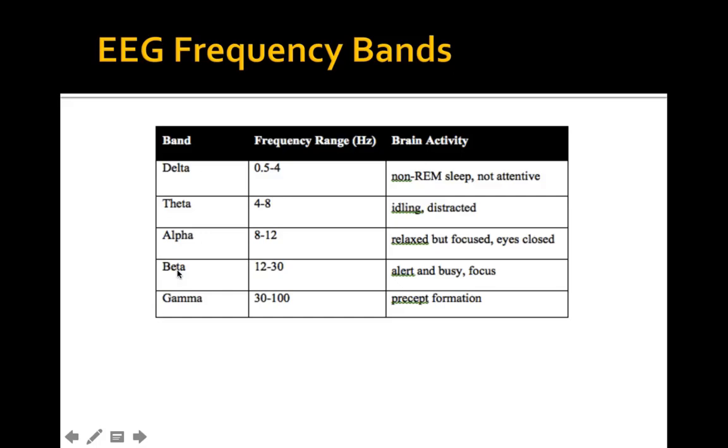The main thing is, if you're reading or writing a paper, it is important to specify how you are defining it and to try to stay within the confines of how people in your field will report this. So for example, if you're working in Alzheimer's disease, it's important to look at the Alzheimer's disease papers and determine how they are reporting the beta activity.